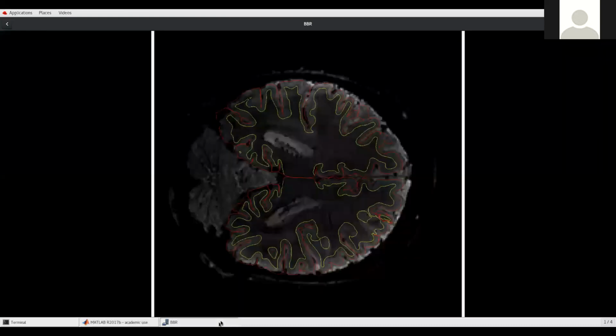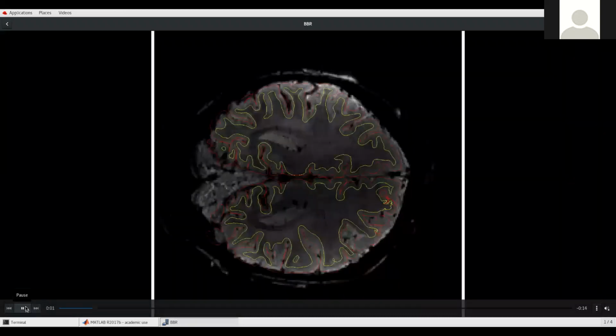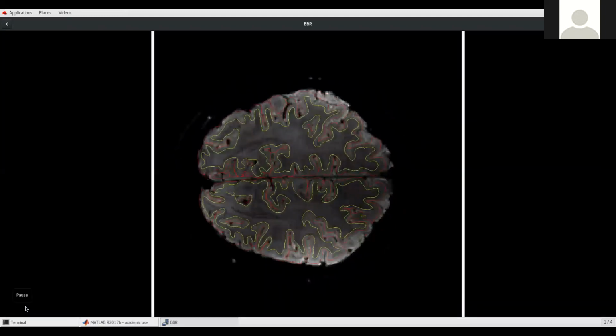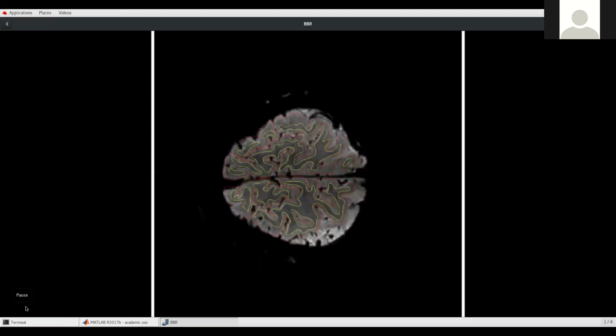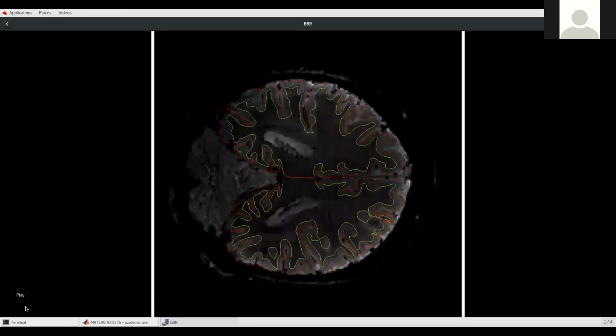The metric you're calculating is optimizing the contrast across this boundary. Yep. And so human observers can look at that and be like, oh, good, oh, missing, oh, oops, right? So what I've been on a quest for in my life is we kind of know what the metric is. We know that we want all of the functional gray matter exactly on top of the anatomical gray matter. Well, we know it approximately. Well, but could it be known in principle?